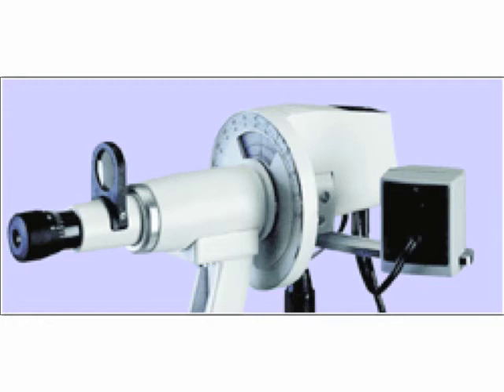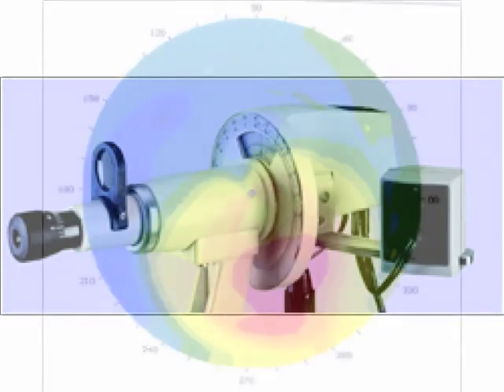This is a little zoomed in view, and there are two different images that are projected on the cornea, and we line them up. I'm not going to go into precisely how this sort of keratometer works, but suffice it to say that we can have a cornea that, let's say, is steep at 90 and is flattest at 10. You'll never get a reading like that with the one-step keratometer like the Reichert that I showed you at the start. You can get that sort of reading with this sort of two-step keratometer.